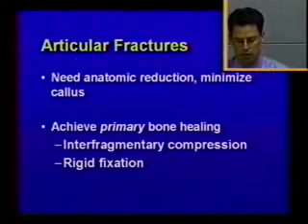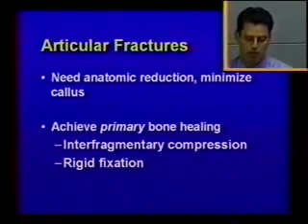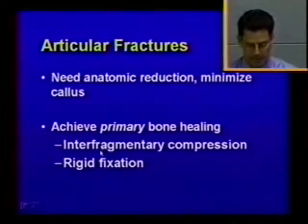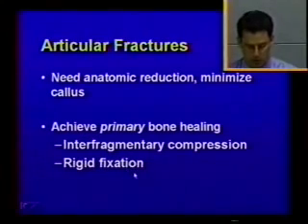When we repair articular fractures, we have to make sure we get anatomic reduction and that we get rigid fixation with primary bone healing. This will help reduce the amount of callus formation and any steps or defects in the articulating portions of the cartilage. Ideally, we're going to want to achieve interfragmentary compression also to help make sure we get primary fixation or primary bone healing.